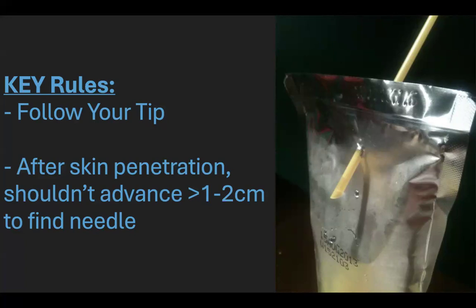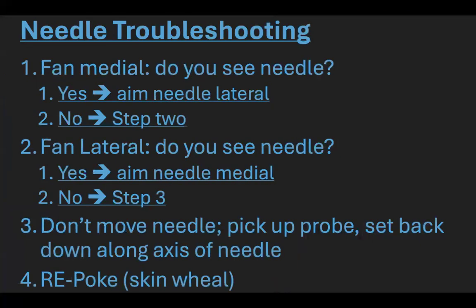But I think it's just another thing to remind yourselves of: just try to not do that. One thing I've also done with residents is, sometimes they're looking at their target structure and they don't see their needle. So we'll have them very pragmatically say, okay, from your target structure, fan medial. Do you see needle? No. Then move on. But if you see needle, then you just need to aim your needle more lateral to get your needle to your target structure, and vice versa.